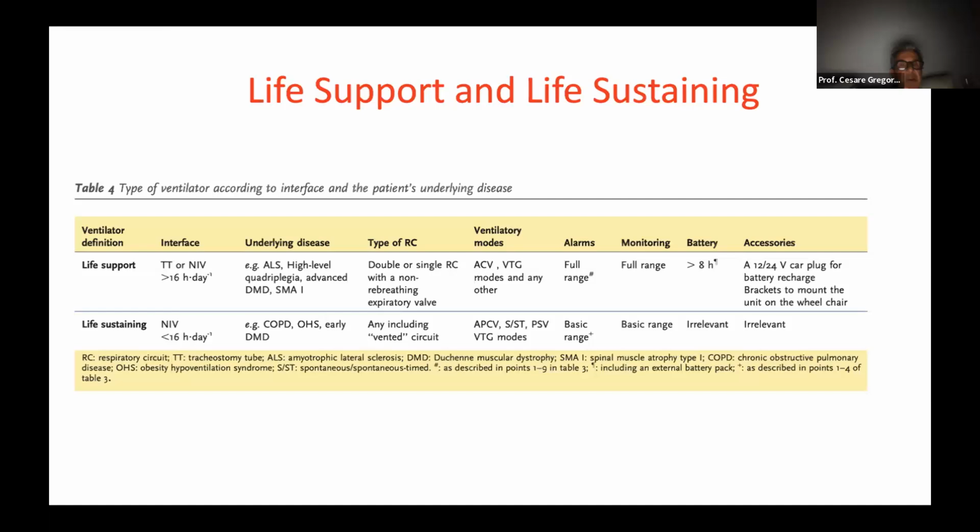Another important difference is to understand well what a life support, a life sustaining ventilator is. Not all ventilators are life support, and not all ventilators are life sustaining. In order to understand the difference between life sustaining and life support, we have to understand the type of circuits and the ventilatory modes, okay?